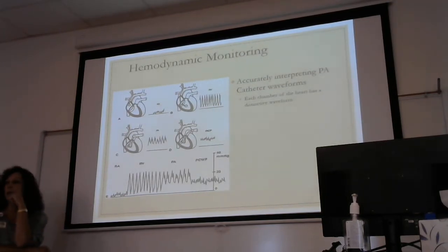Can I advance this catheter? No. Absolutely not. Can medicine advance this catheter? Think before you speak. And then if you're having to question that in your brain, ask yourself this: can you advance a Foley catheter that's been partially pulled out? Yes or no? Okay, why not?